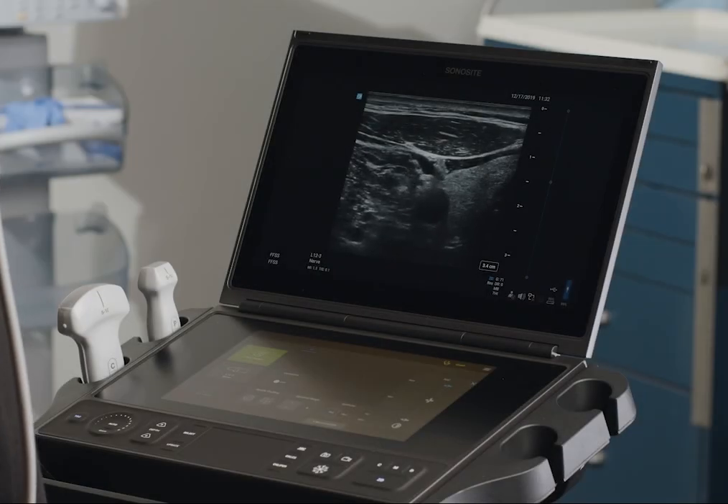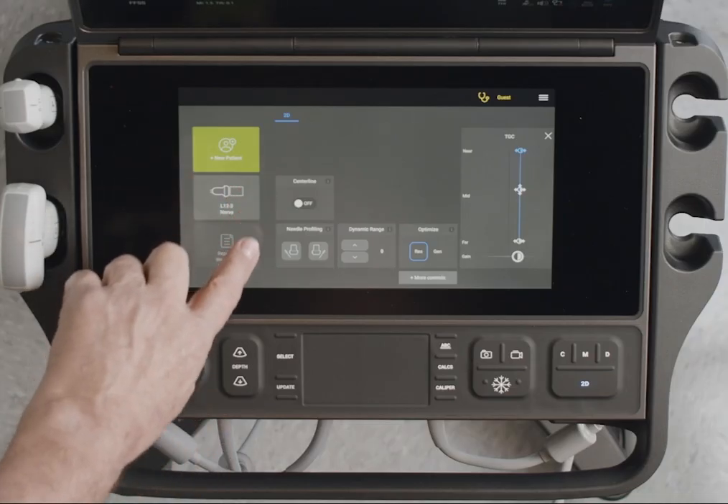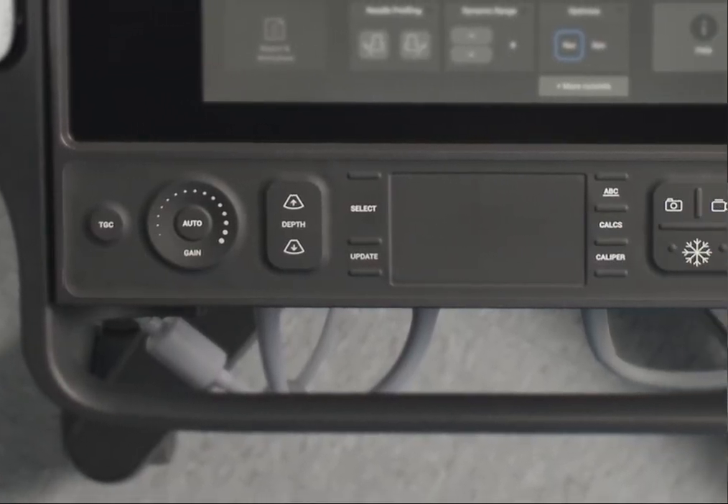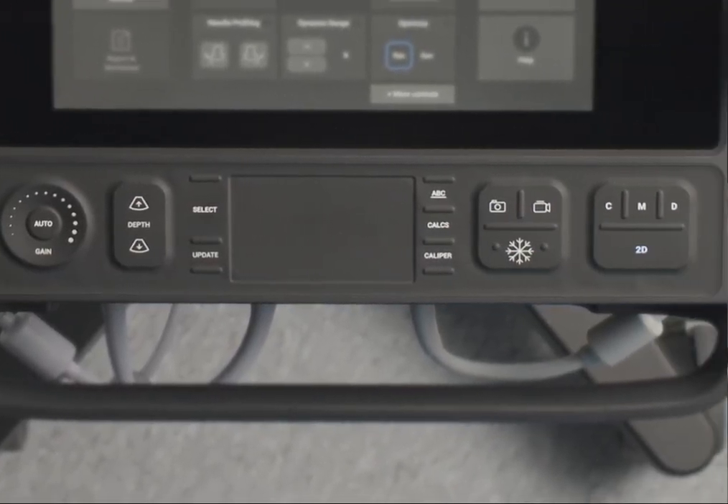Other features include a touch panel with imaging controls to help you optimize your image. Physical controls let you adjust depth and gain, label your image, take images, clips, and measurements, and change modes.